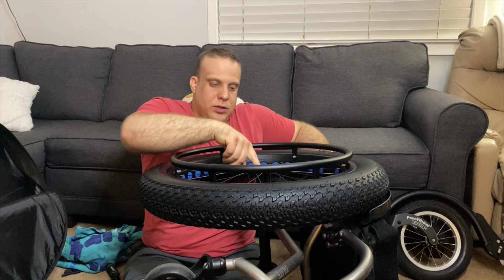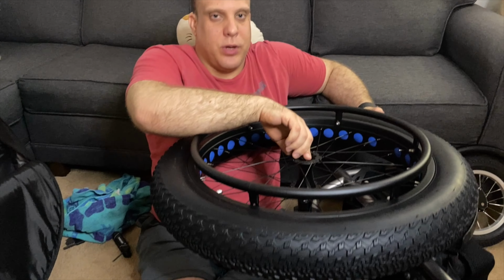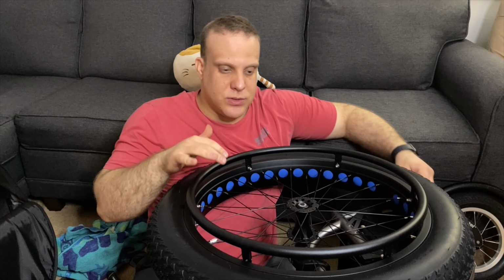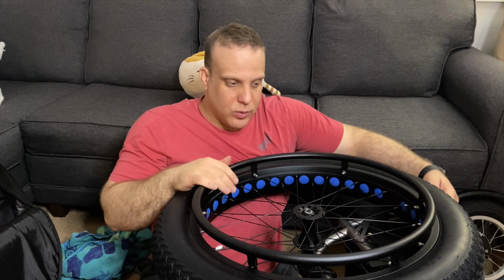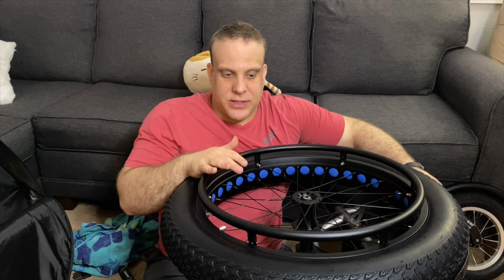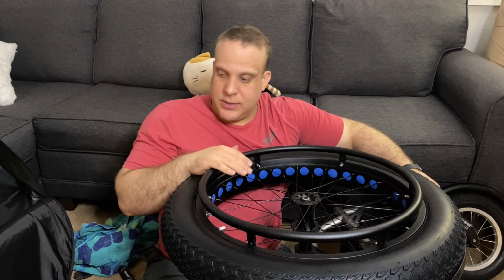So also, just so you guys know, these axles are pretty dry. They're actually completely dry right now, because I haven't used this chair out in, quote, the real world yet. So I haven't lubed them up, but I would highly recommend, anytime you get new axles at all, put some lube on them.